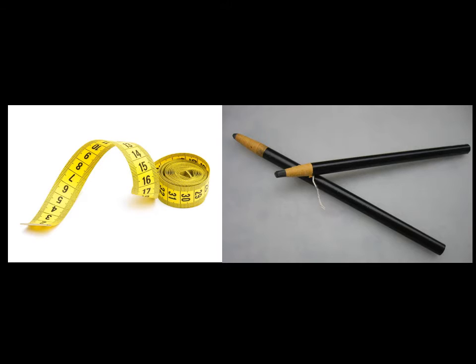The placement of surface EEG electrodes starts by determining bony landmarks. The only instruments needed for proper surface EEG placement are a measuring tape and a non-toxic skin marking pencil.